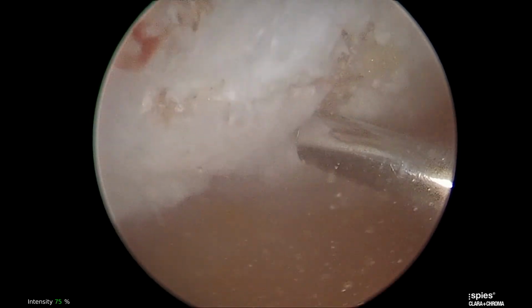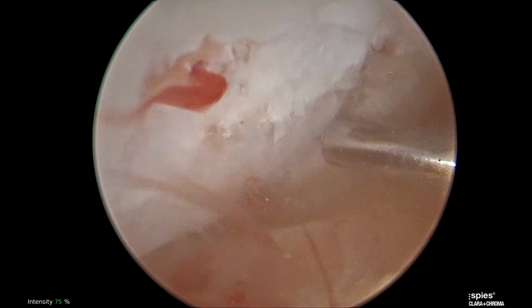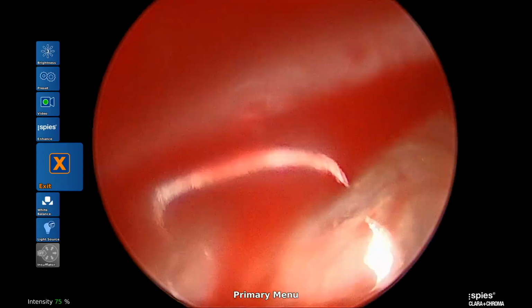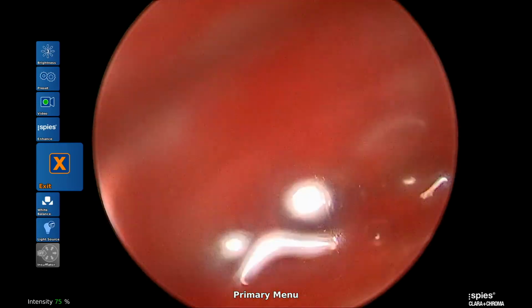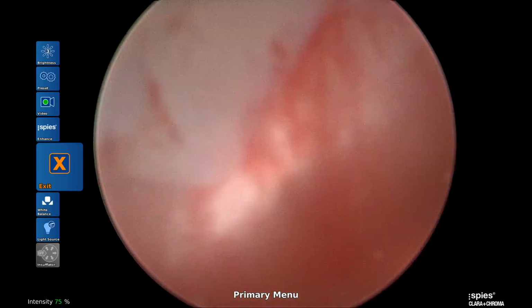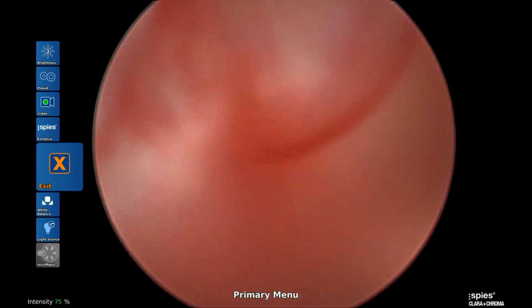And I think the best part was to see that once we applied a little suction, took off the pressure, we got really great flow from a tough area. This is the patella. You can see how much bleeding we got right from those lesions once we got the SmartShot device to make the little marrow access holes.